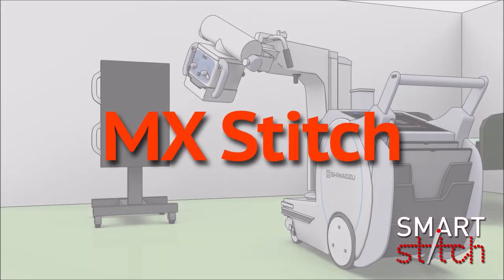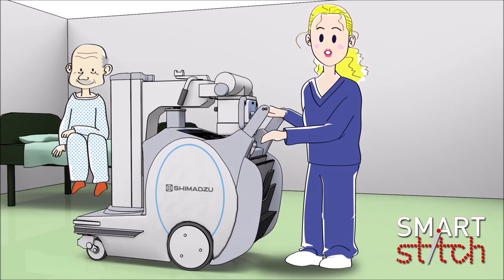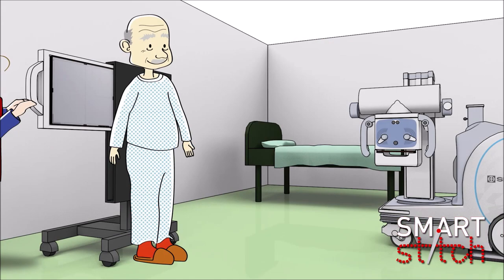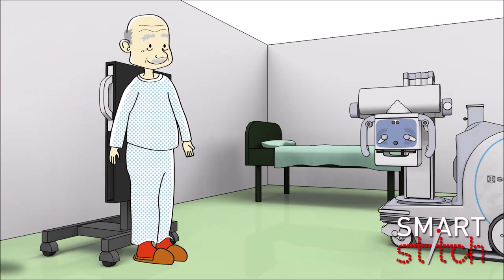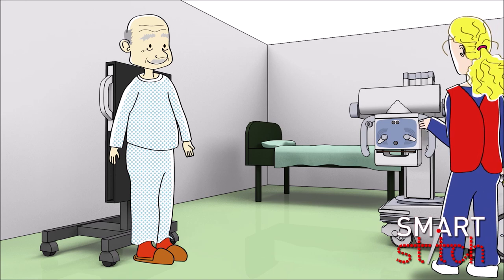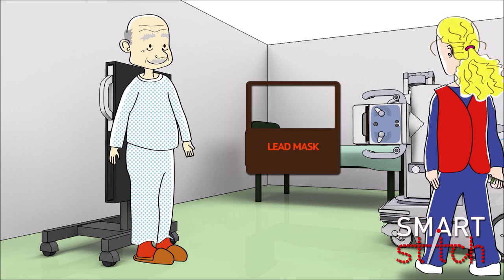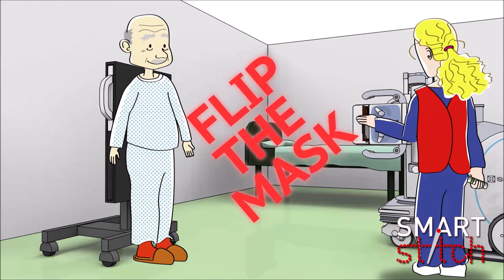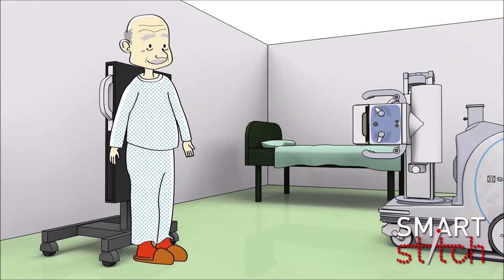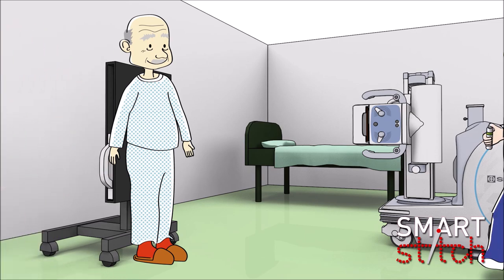MX Stitch. MX Stitch can be performed in virtually any space, as it is operated using a mobile X-ray machine. In order to perform the MX Stitch, two images are scanned of the necessary area, and the panel is readjusted by the technologist between each scan. During the scan, in order to minimize exposure to radiation, a lead mask is placed inside the collimator slot so that the scan is only performed on the body parts in front of the panel. This prevents the same body parts from being exposed multiple times during a large area scan.